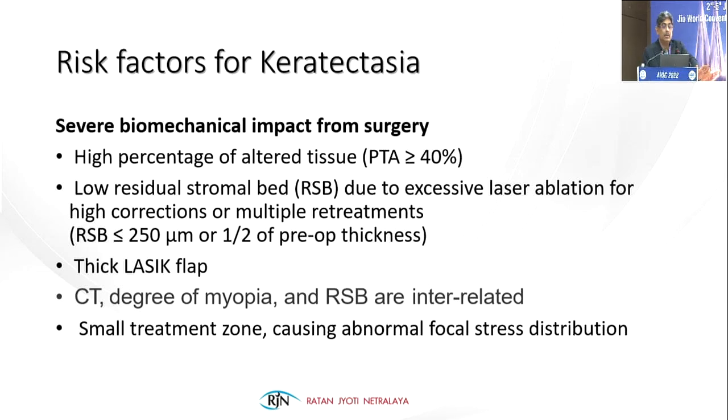So we should be including the flap. We should not exclude the flap, because after the flap is created, it doesn't have any value. Another risk factor is a low residual stromal bed due to excessive laser ablation for high corrections or multiple retreatments.